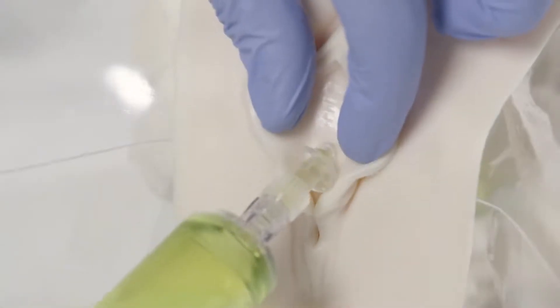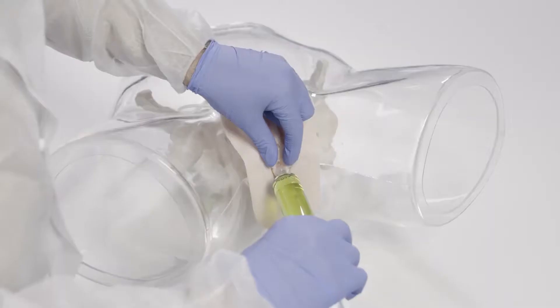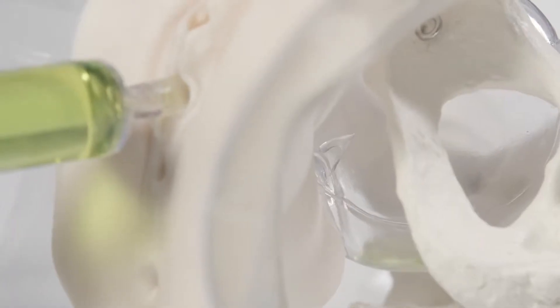I move the tip of the yellow adapter into the orifice and after a minimal penetration I start the installation, filling the bladder with 50 ml glycosaminoglycan solution.